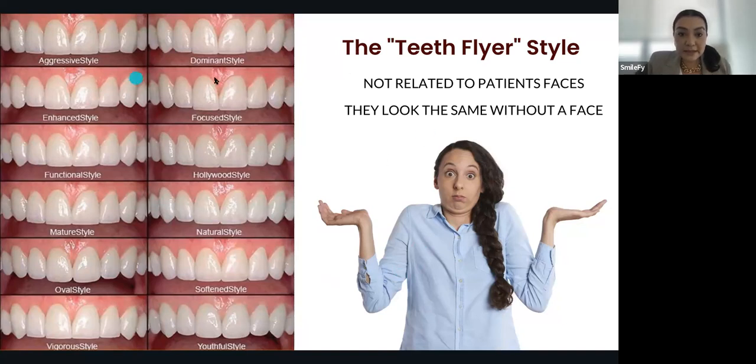So let me see. Close this question. Nothing that is related to the patient brings emotion. The way you communicate needs to be smoother, but also working with the picture. Otherwise, you don't impact the patient.